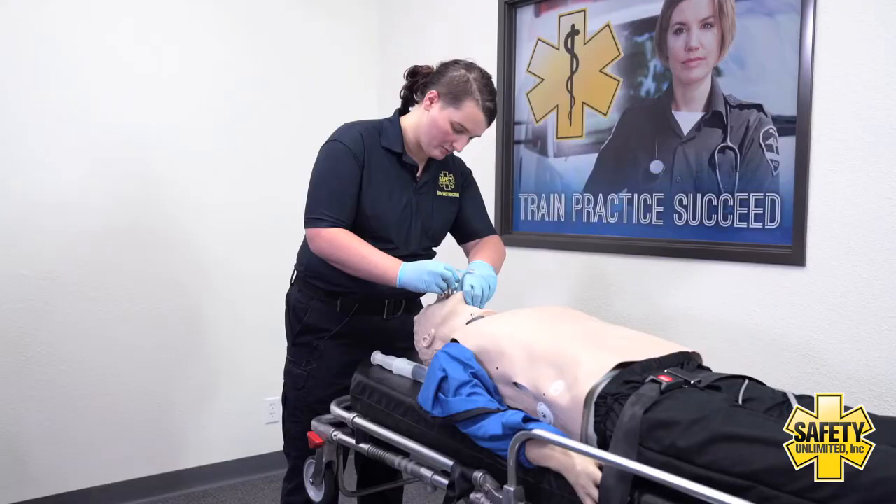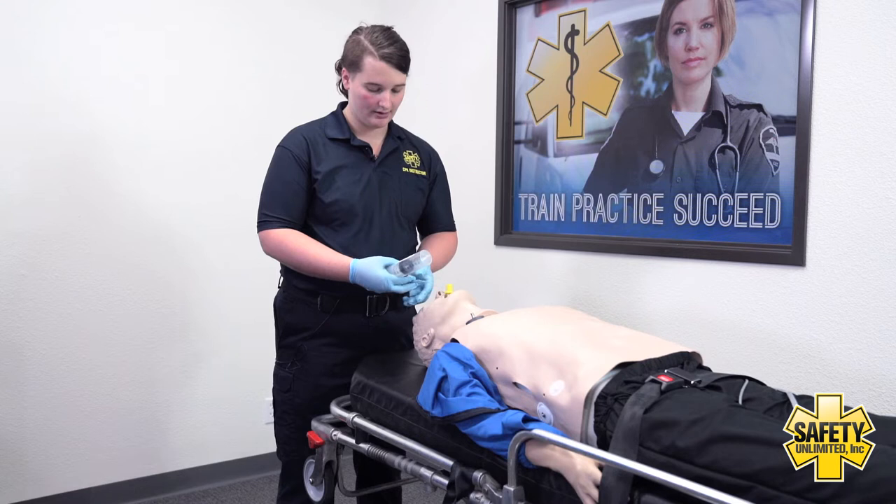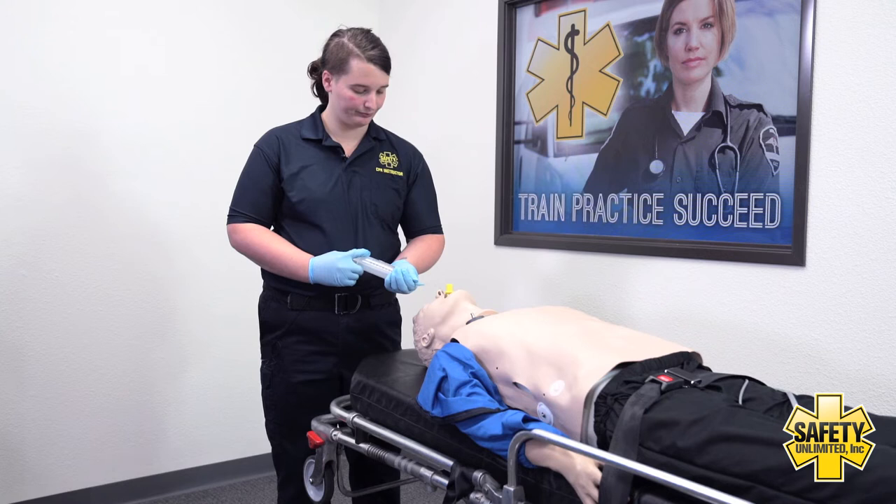I take the tongue with my thumb and place the tube until it's at the teeth. Then I'm going to insert the proper amount of air per my policies.